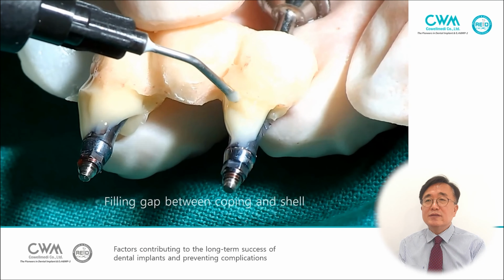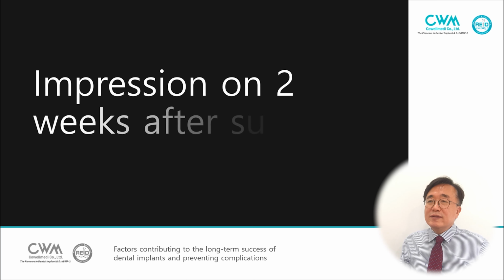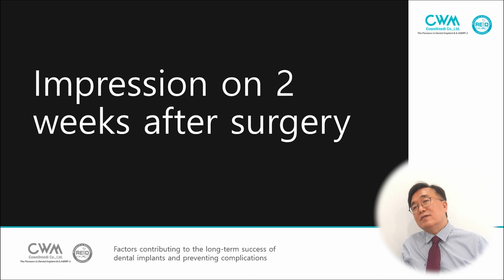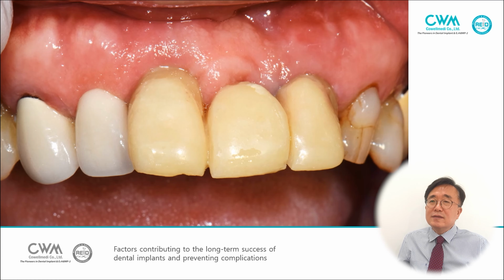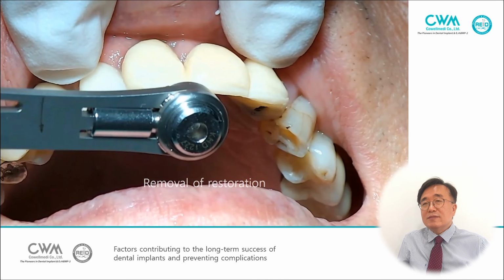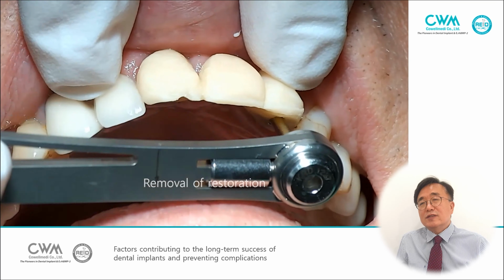Occlusal check. Result of surgery. The buccal bone graft is good. After 2 weeks, this gingival line is maintained and the restoration is removed.